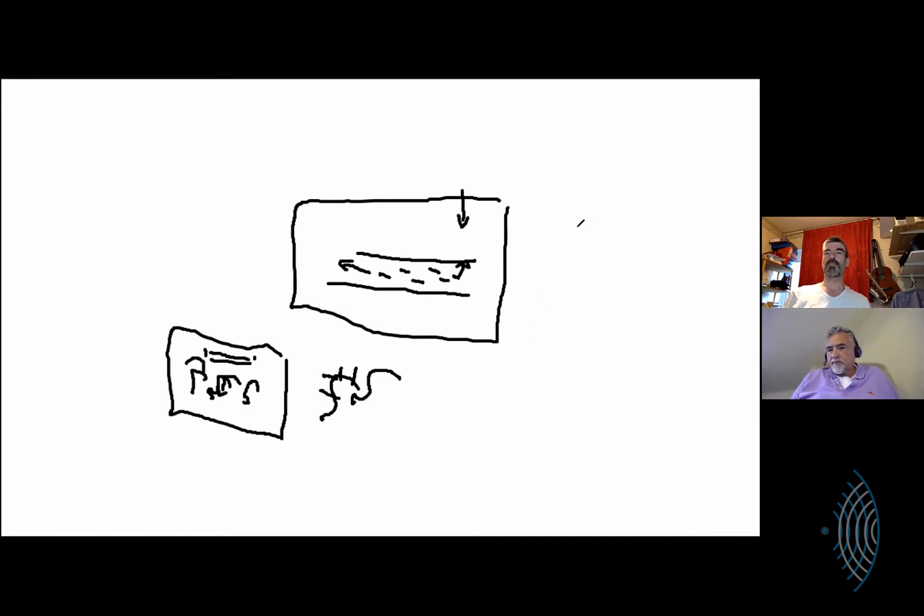So when I'm looking for the complex microvascularity in a cancer or neovascularity in a tendon, I am going for the low-hanging fruit, the stuff that is actually going in this direction, because there is always stuff traveling in this direction. And by selectively targeting those, which I do with my color, I can then actually be more sensitive before any movement of my probe creates too much noise in the picture.